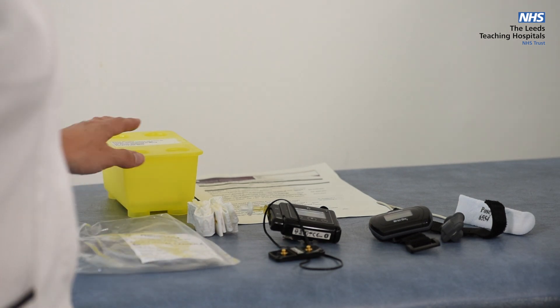Hello, this is the sleep department and we're going to show you how to put your sleep equipment on to measure your sleep study for tonight that you've picked up from the department. This is the equipment you will have received.